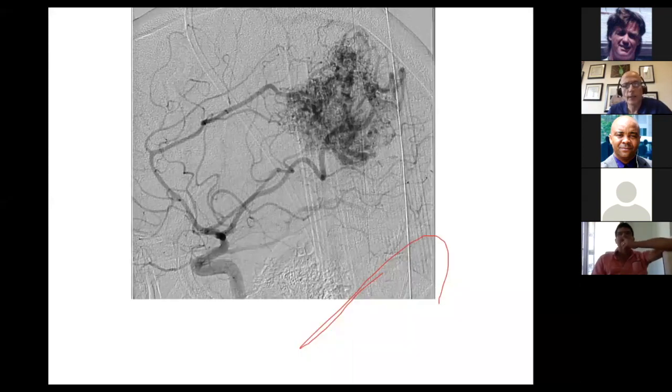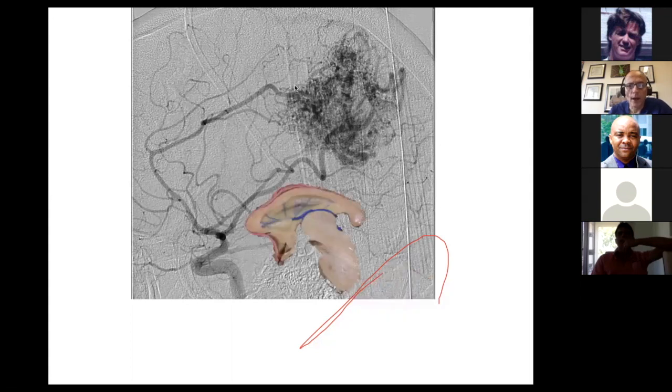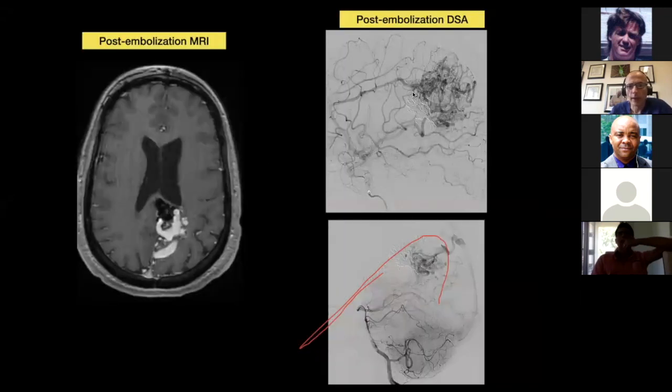And in this case, again, this is one of the old cases. I said, maybe I should embolize, not the anterior superficial feeders, but the posterior feeders from the posterior cerebral artery, because they will be deeper. And that's what we did, okay? Just embolize enough, like my mentor, Dr. Hieshima, taught me. But it turned out it wasn't even necessary. Why did I subject the patient to another procedure? Embolization is not a risk-free procedure.